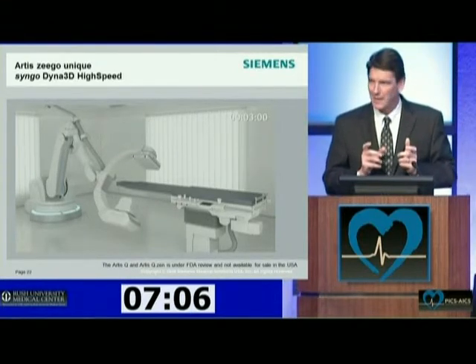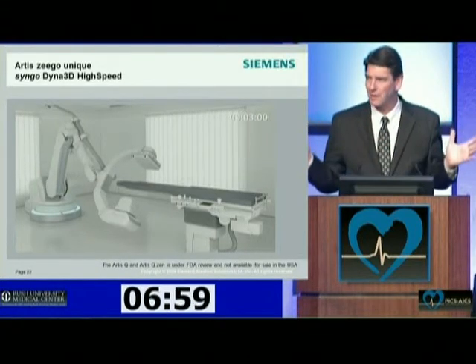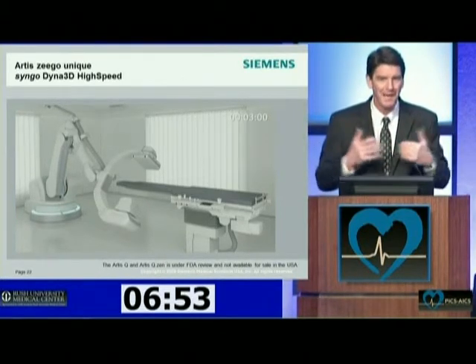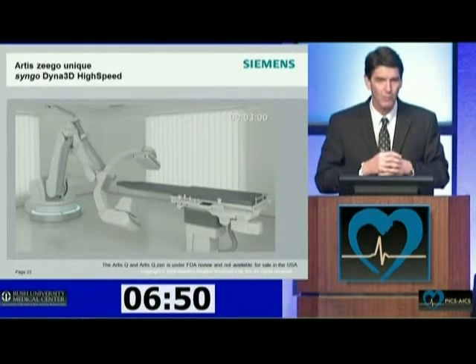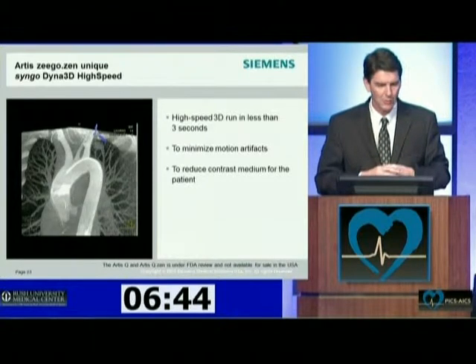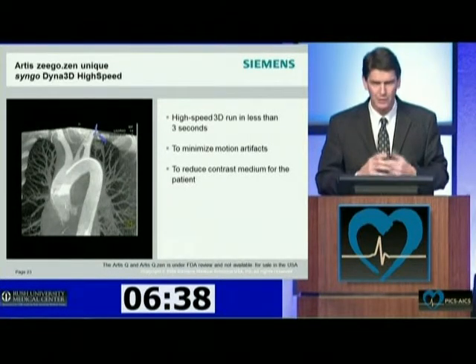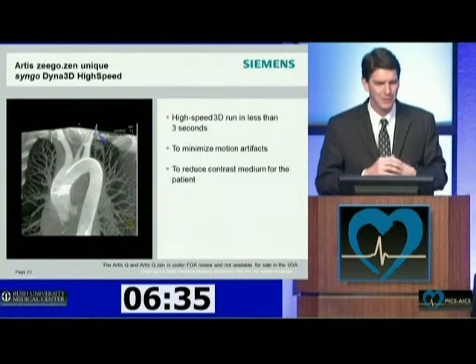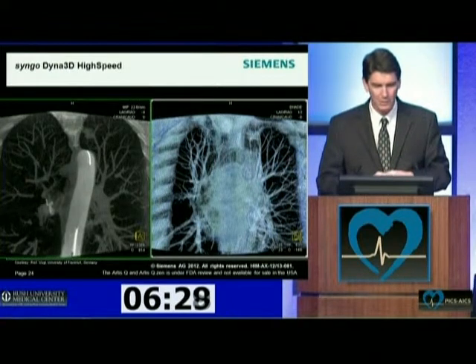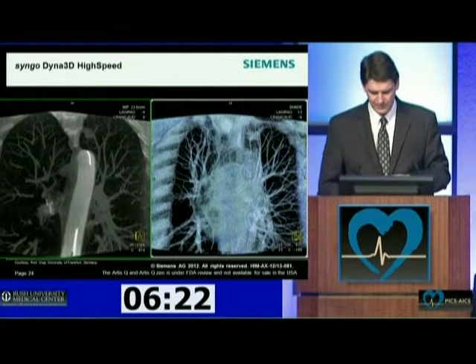The benefit, I think, once again, from the pediatric perspective is the volume of contrast medium you need to inject. Now you're not looking at a 4 or 5 second acquisition, you're actually looking at a 3 second active acquisition. And granted, the protocols typically have the injection starting just before, but there's an overall reduction in the volume of contrast needed. And it's also obviously geared towards motion. I don't have any images here representative of pediatric patients, and I think you don't actually have that motion issue because you ventilate your patients and you can freeze the breathing motion, but just some ideas of how you can also deal with motion, and at least for older patients, you have to hold their breath. The breath hold time is not as significant.